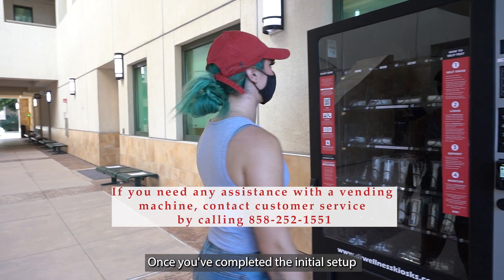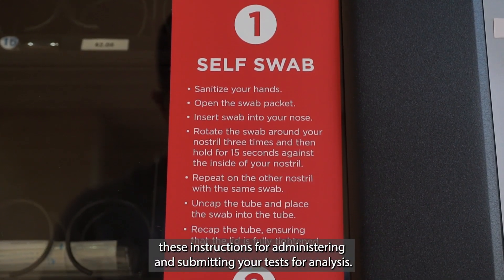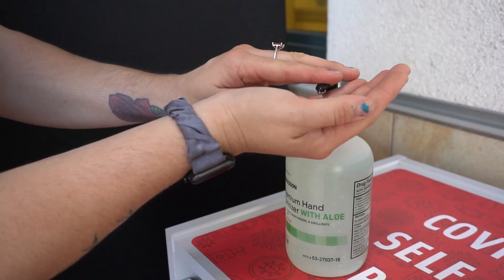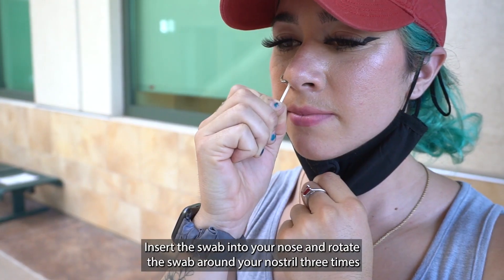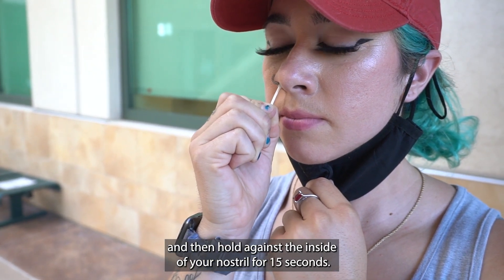Once you've completed the initial setup and arrive at the vending machine to retrieve your test, follow these instructions for administering and submitting your test for analysis. Step 1: Take the test. Sanitize your hands and open the swab packaging. Insert the swab into your nose and rotate it around your nostril three times, then hold against the inside of your nostril for 15 seconds.